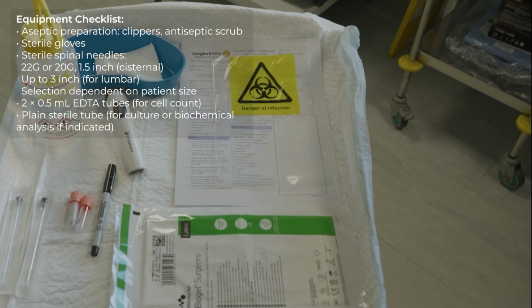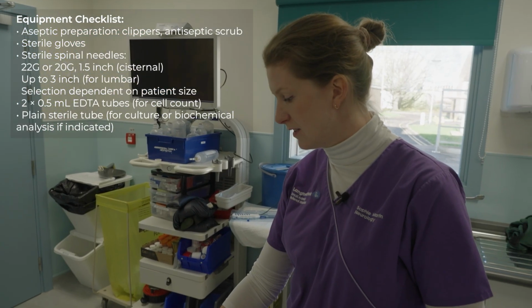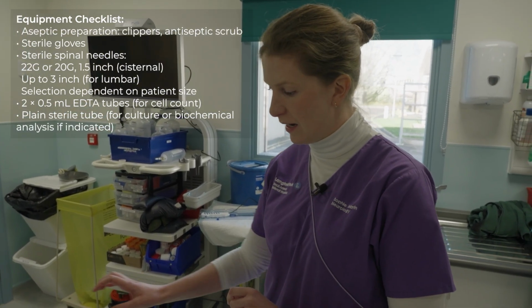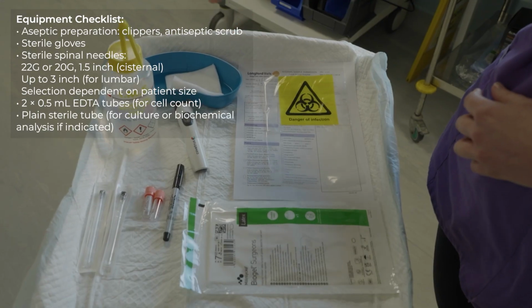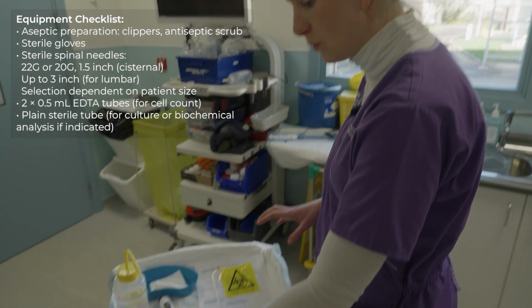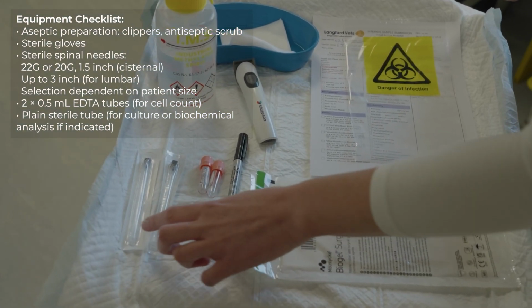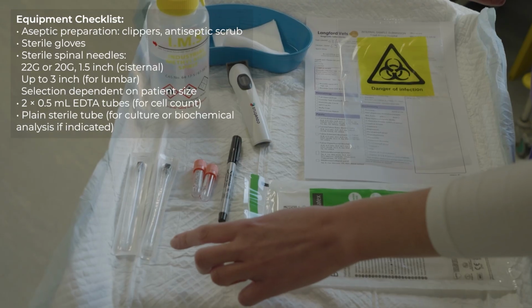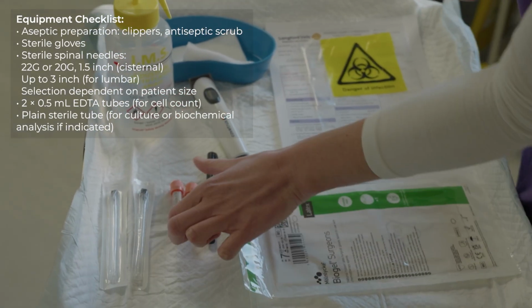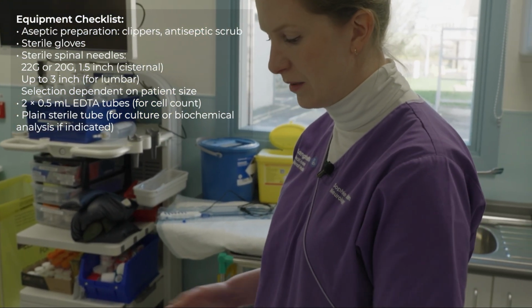This is just equipment for aseptic preparation of the skin. So some clippers to clip the fur nicely, some dilute Hibiscrub to clean the skin initially, and then just before we take the tap, we also use some surgical spirit on the skin. What we'll also need ready is some sterile gloves, and then we'll need a 22 gauge needle. The length of the needle varies depending on if we're taking cisternal or lumbar CSF. So taking cisternal, we'll use a shorter 1.5 inch needle. And then your collection pots, we use 2 half ml EDTA tubes, and then your lab submission form, and then something to label your pots with.